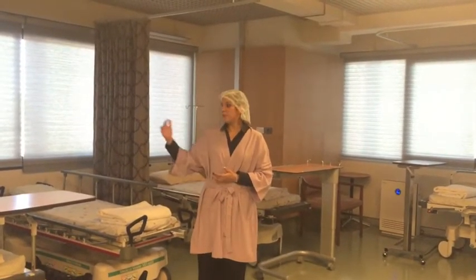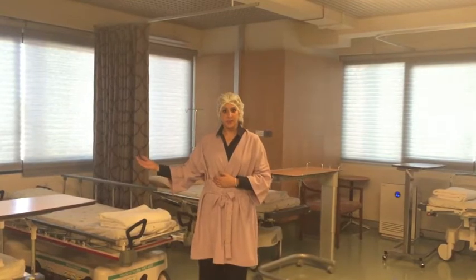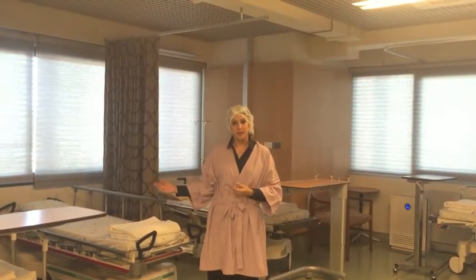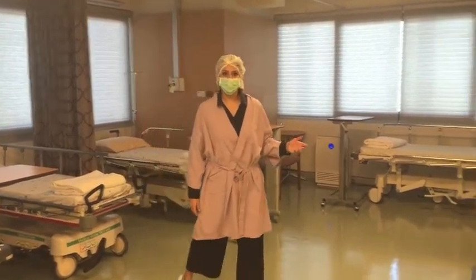Pre-post-egg collection, the patient lies down here under the supervision of a certified nurse, where they get enough rest. Once the patient is ready, the nurse escorts the patient to the egg collection room. Once the egg collection has been done, the patient then comes back to rest here. Under the supervision of a certified nurse once again, they're monitored for the vital signs, the conscious level, just to make sure that their condition is stable. Now I will take you to the egg collection room.